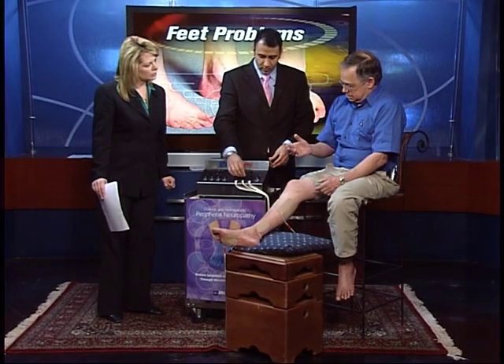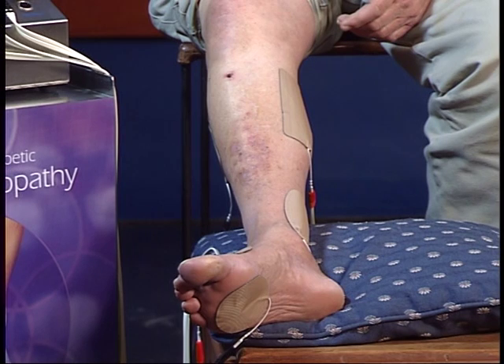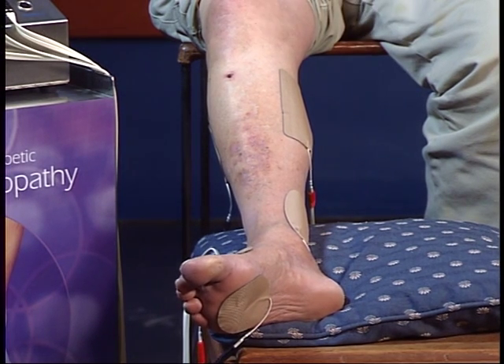John, what are you feeling as it goes? As he turns it up, right now I'm not feeling anything, but he'll turn it up a little. There it is — you can see his muscles contracting. And that just tingles.